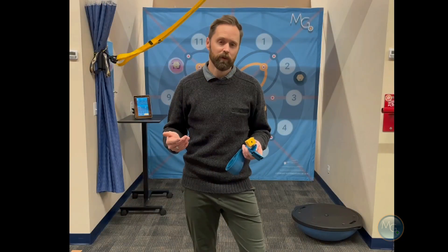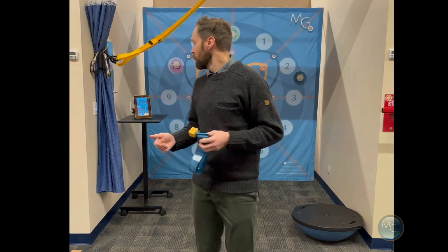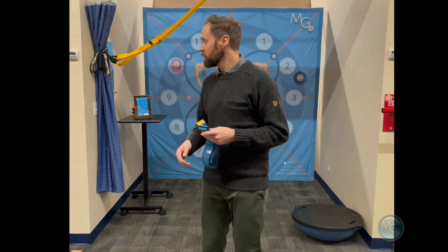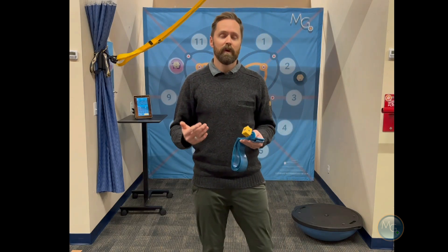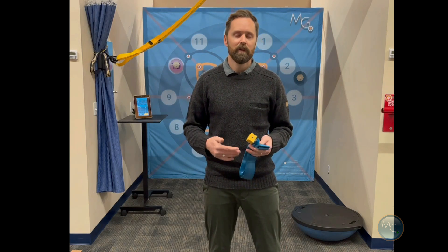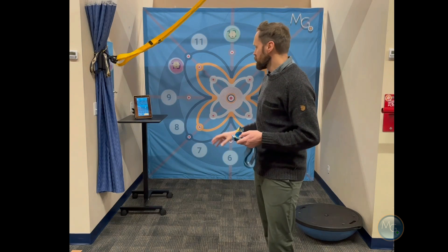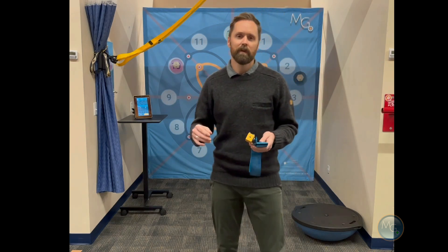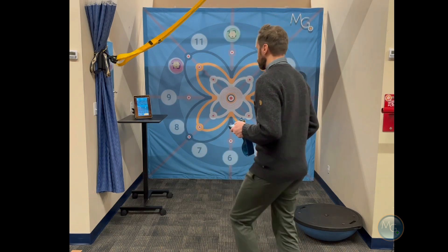Another cool game to demonstrate is the dual focus game. This uses our Motion Guidance interactive system with the app, and I'm going to be using the NeuroStation with three targets set up. The purpose of the game is to add different cognitive challenges and also an element of reaction time. You can make different letters appear faster or slower on the screen, and you can make the pods turn on faster or slower.